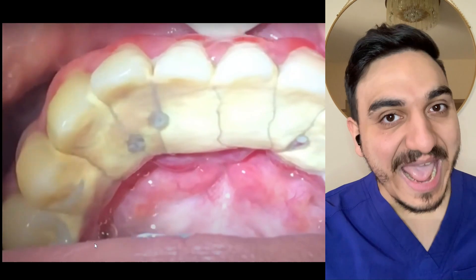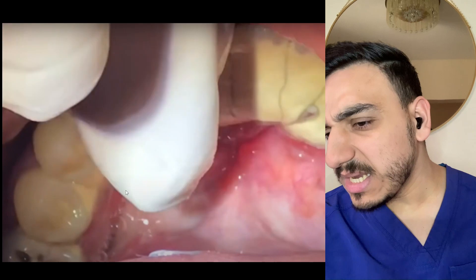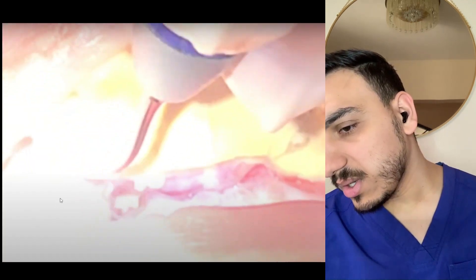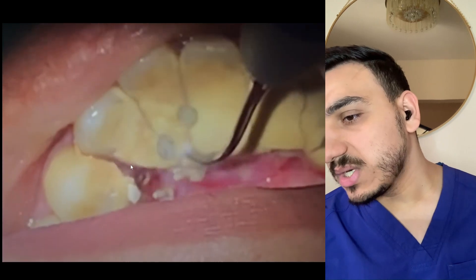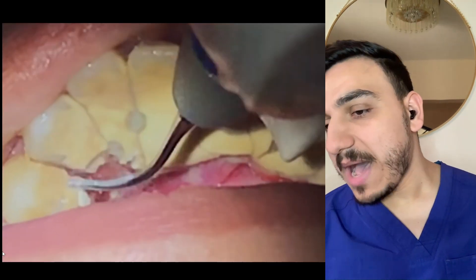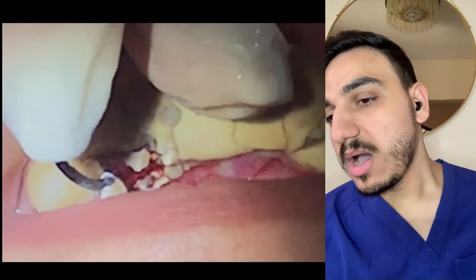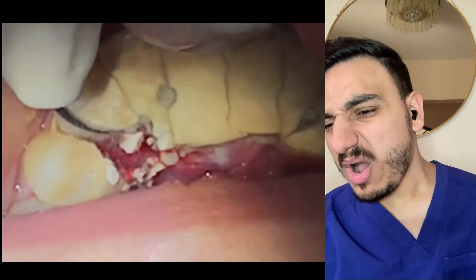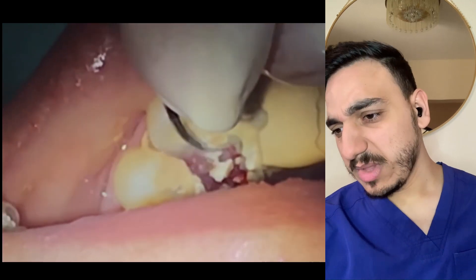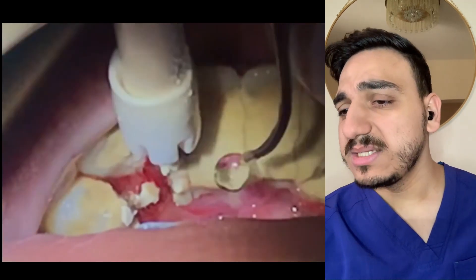Very, very heavy dental calculus and dental tartar deposits, even covering what we call the occlusal surface of certain teeth. It's extending up to like the upper third of some teeth — so we have the lower third, middle third, and upper third of a crown. There are just huge deposits of calculus being removed.